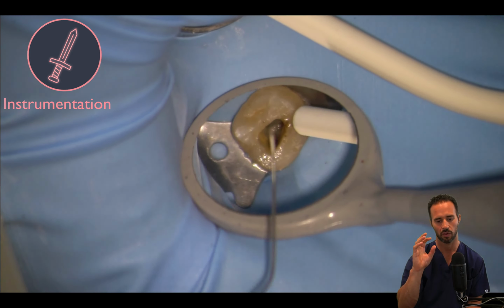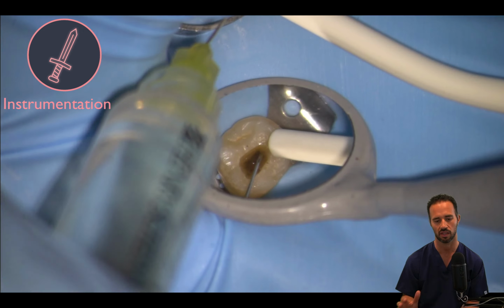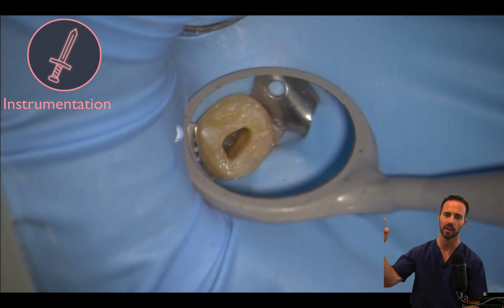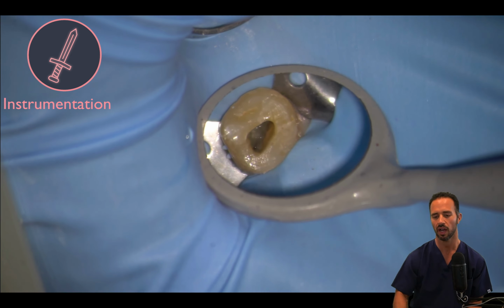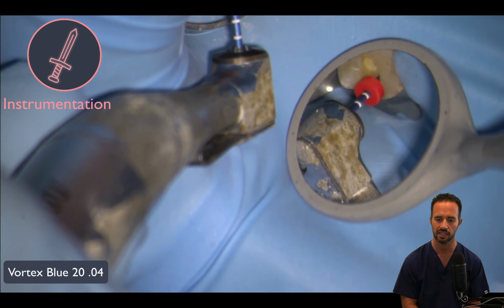So that was our palatal canal, and now we're going to go ahead and irrigate with our sodium hypochlorite. Again, in just the 3 main canals for now. So that looks good, and we're just working our way up the ladder, just like we do in all our cases now. So we're going to go up to our 2004 Vortex Blue rotary file, first in the mesial buccal to 18 millimeters.